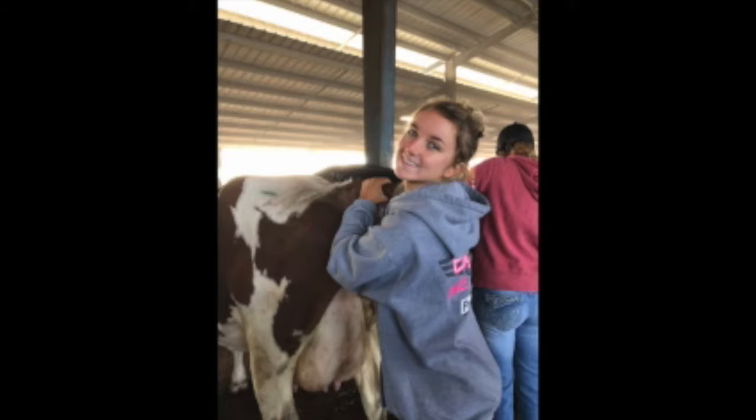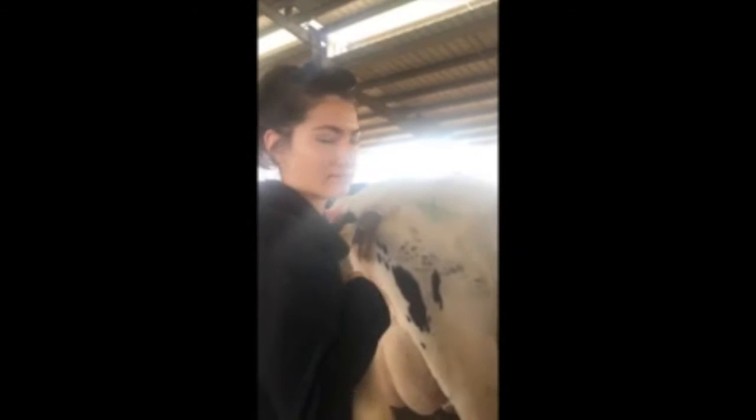A tip for finding the cervix and palpating a cattle reproductive tract is to sweep your fingers to first find the pelvic bone. After locating the pelvic bone, it is easy to trace fingers caudally to then find the cervix. It is important to note the difference in temperaments of cattle breeds can affect the ease of palpation and artificial insemination.